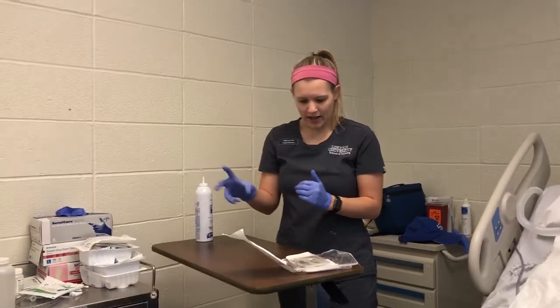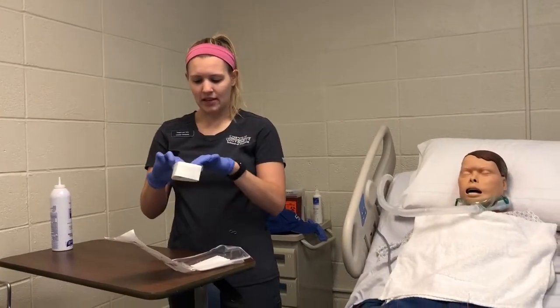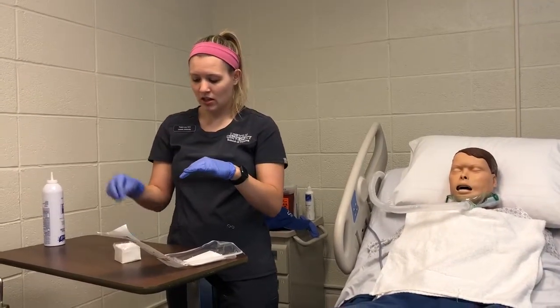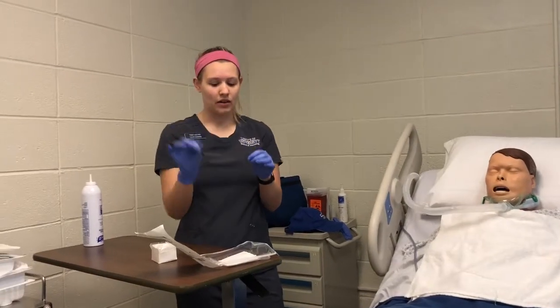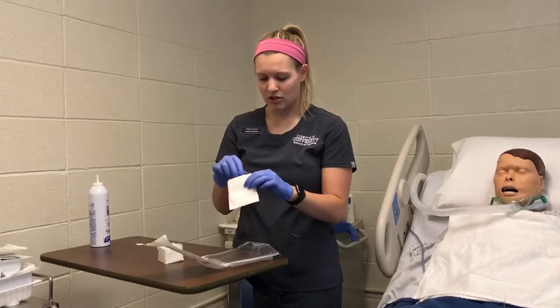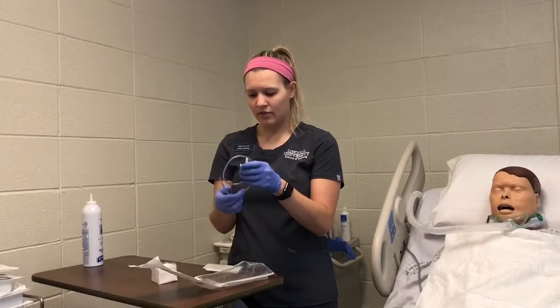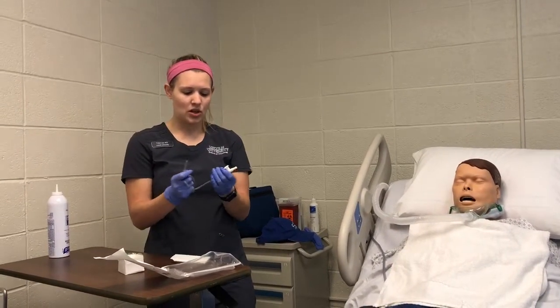And get rid of that. So in here I have this little tray that I can put saline in. For this demonstration, I'm just going to simulate that I have some saline in there. That's just what you use to clean out your suction catheter, in between suctions if needed. So now this is my suction tube.